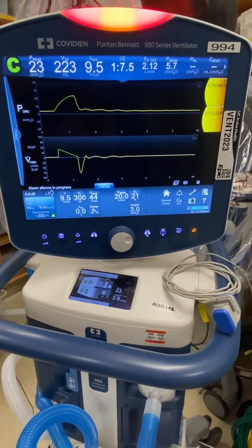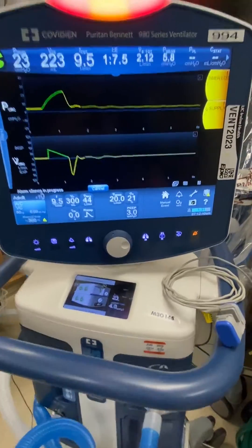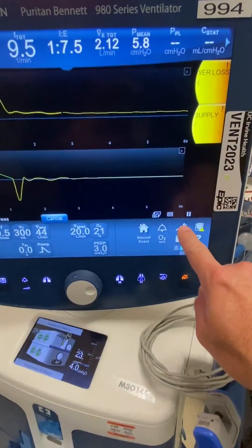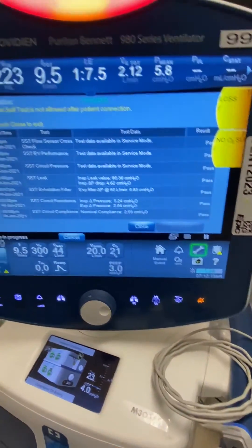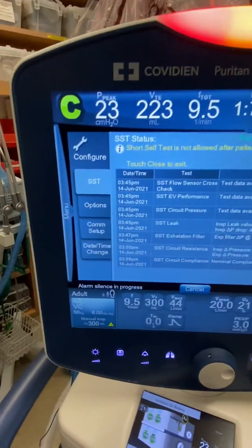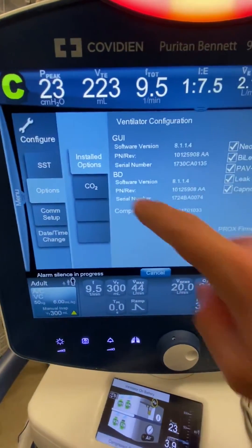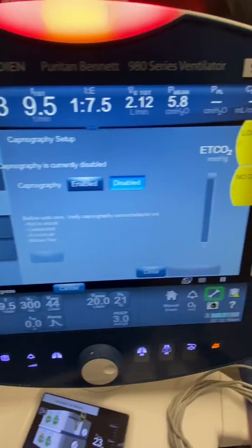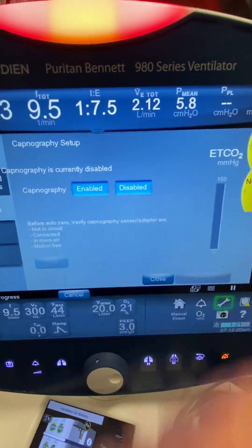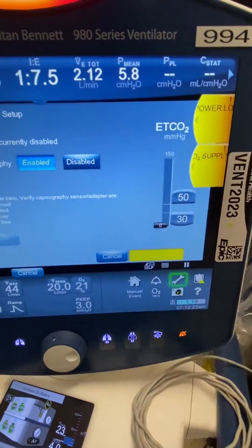So the first thing that you want to do to activate the end tidal is to hit this wrench here, and then you're going to go to Options, CO2, and then you have to enable it, and then hit Accept.